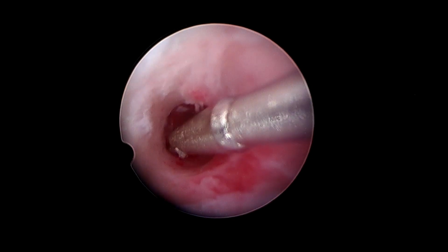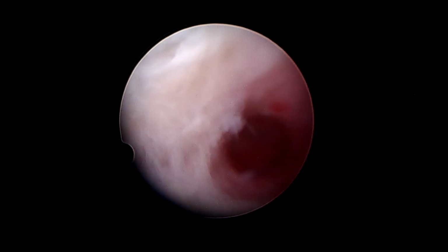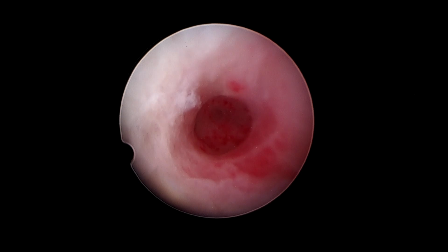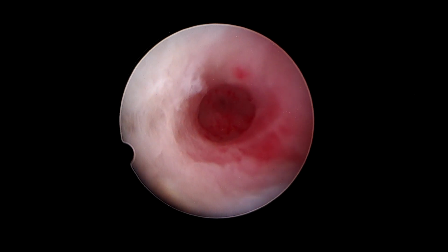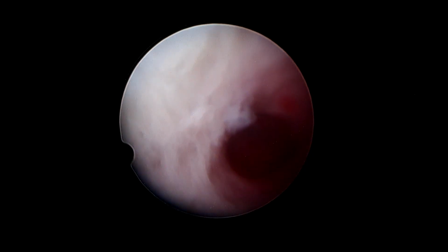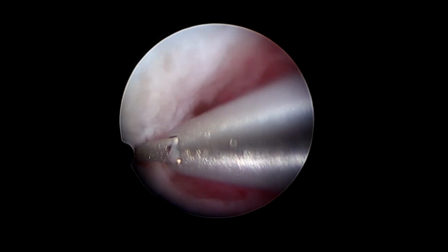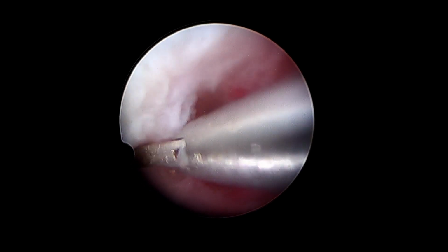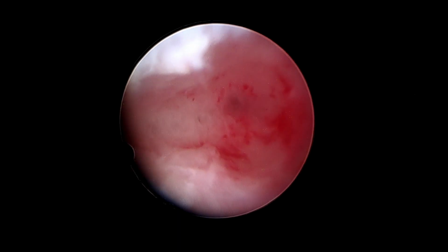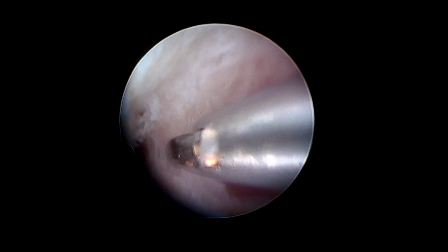Now you can notice, as we have mentioned, in the mid cavity we had some islands of endometrium, and you can see the ostium of the left fallopian tube. From here again, you go exactly in the center of the adhesions and try to cut it bit by bit, and try and reach towards the fundus. And here also you can see the islands of endometrium in the fundus.